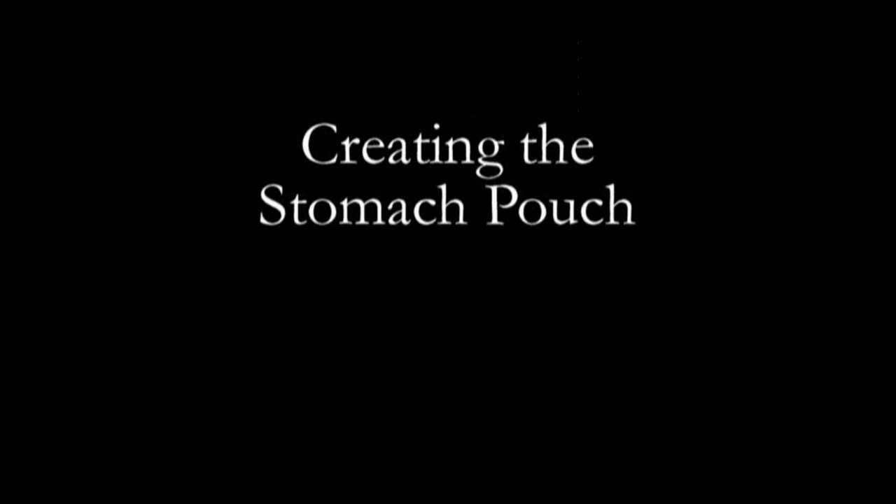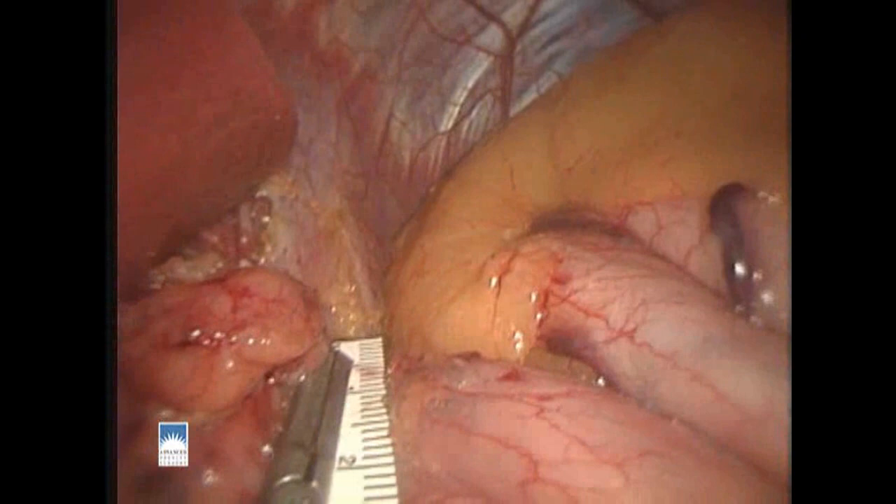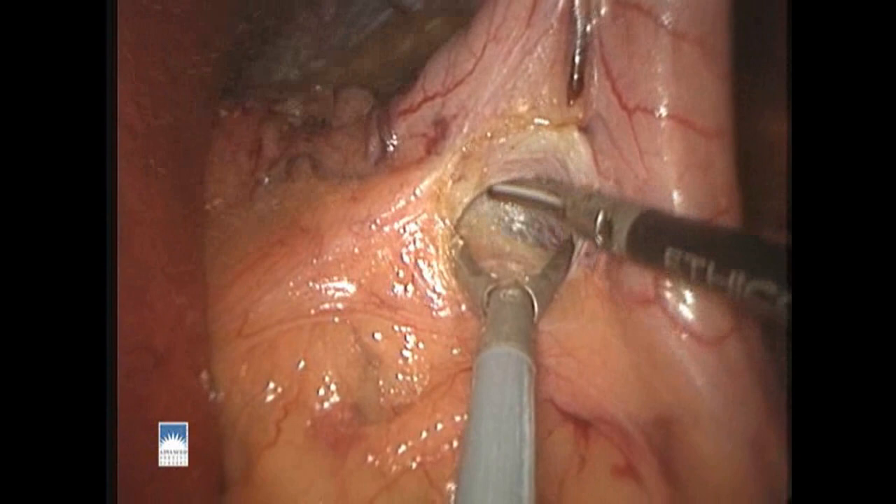Our first step in creating the stomach pouch is to dissect out the tissues where the esophagus comes through the hiatus, or the diaphragm muscle, and this is where the stomach begins. We then measure down from the top of the stomach to a certain point along the lesser curvature of the stomach. Next we'll make an opening in the fatty tissues alongside the stomach so that the stapler jaws will be able to access the anterior and posterior surfaces of the stomach.